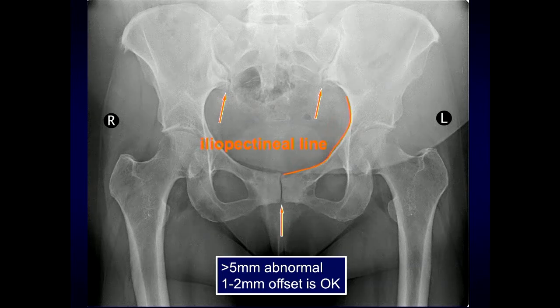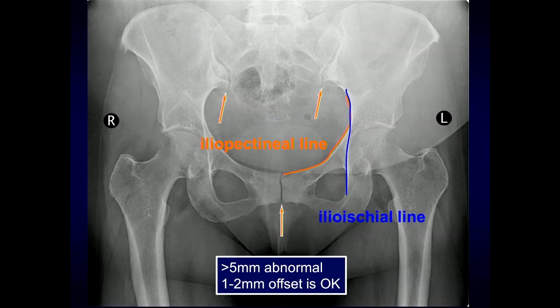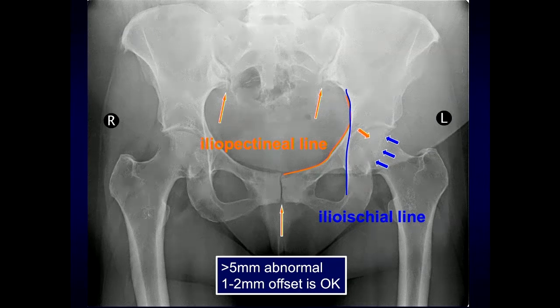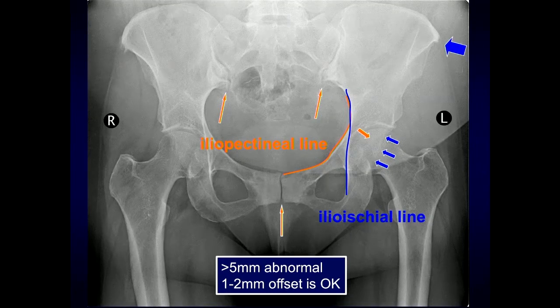Another line we can evaluate and closely scrutinize is the iliopectineal line — there should not be any discontinuities or offsets — as well as the ilio-ischial line. Additionally, we want to look through the femoral head and find that posterior wall of the acetabulum in comparison to the anterior wall, which can help you to look for posterior wall acetabular fractures. Don't forget about the iliac wings, looking for fractures in this location.